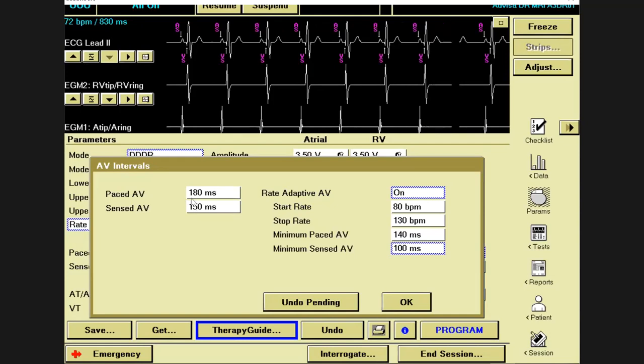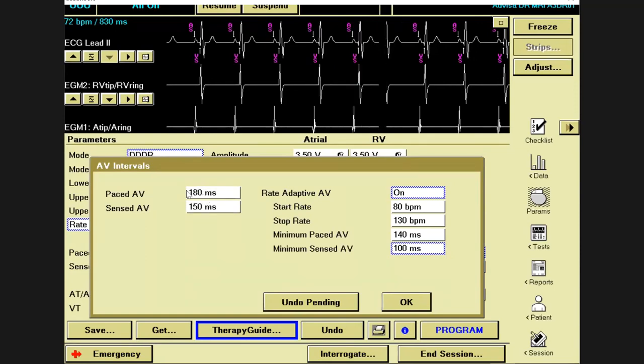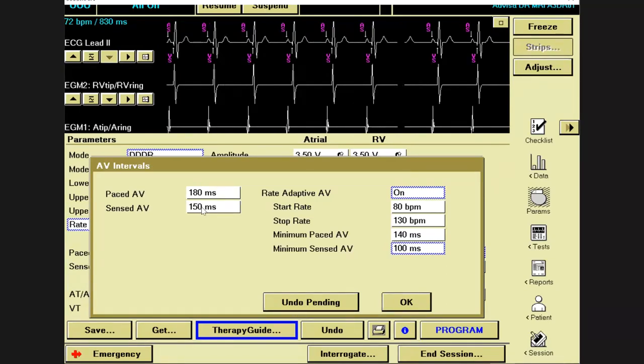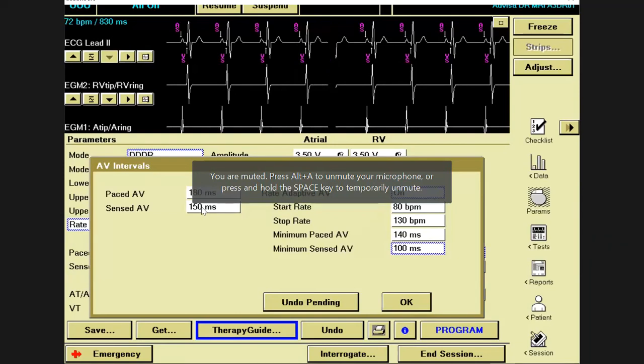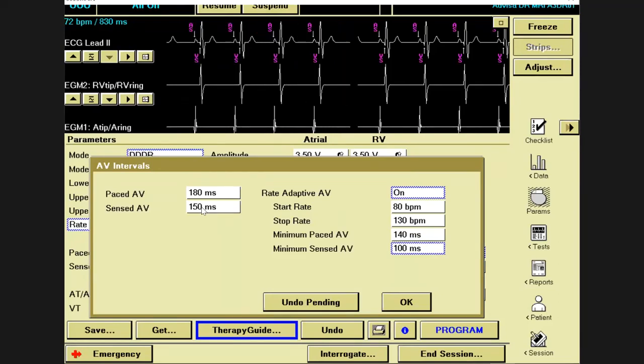So then the atrial contraction starts only on an atrial pacing. Ideally, it's good to have a slightly longer AV interval. If you program unphysiologically short AV intervals, then you are preempting the ventricular pacing. Sometimes, if it is a sense-V pace, it might even encroach on the P wave. Before the complete atrial contraction, you may end up pacing the ventricle.